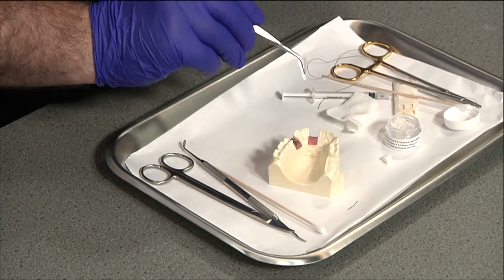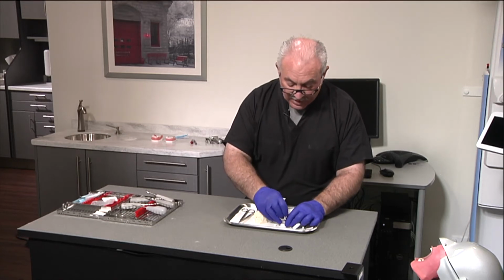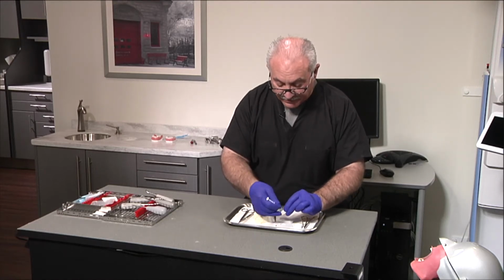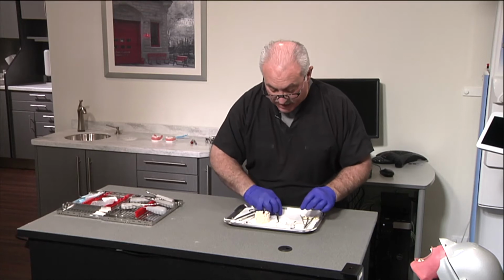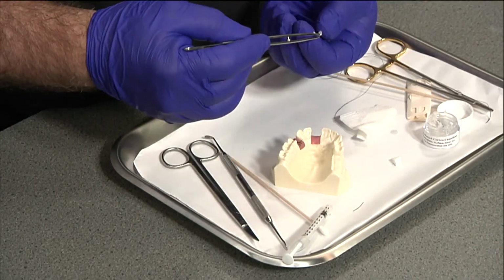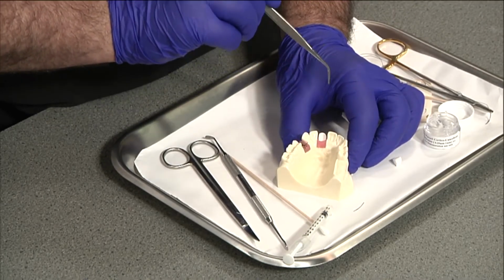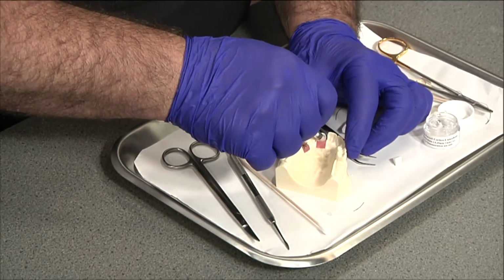And again, this is where you and your assistant are ready to go. The syringe is full, the 2x2s are ready, and the cotton tip applicators are ready. Once you place this membrane, you have to act fast to get the material in there, because once it gets wet, it will slump. So you have it ready, you place it in the socket, and now you have a ramp within the alveolus, a ramp with which to pack your bone against.